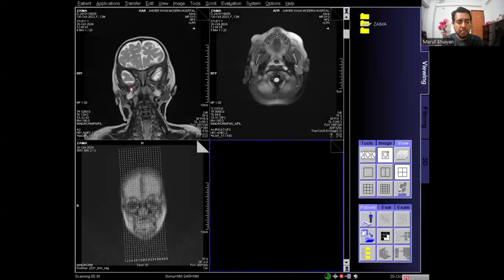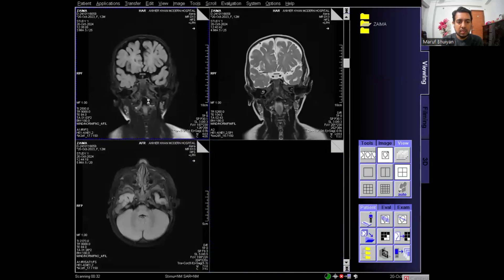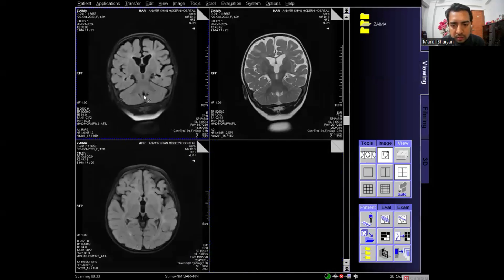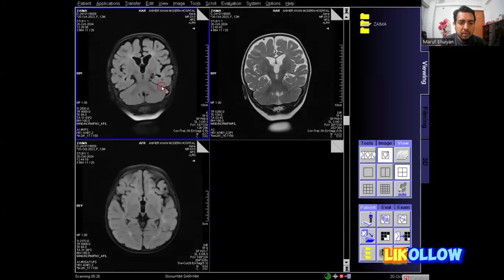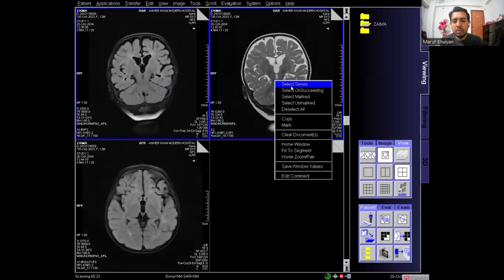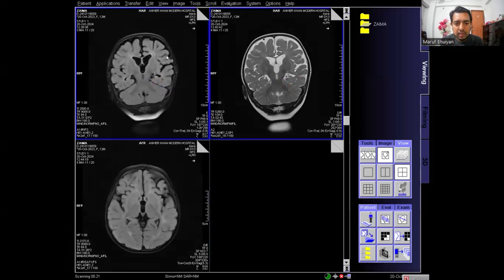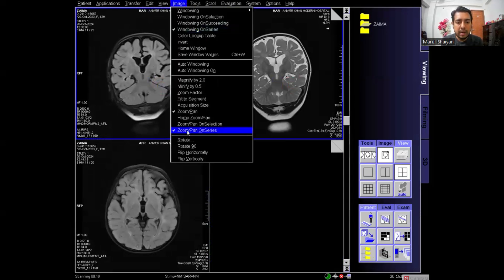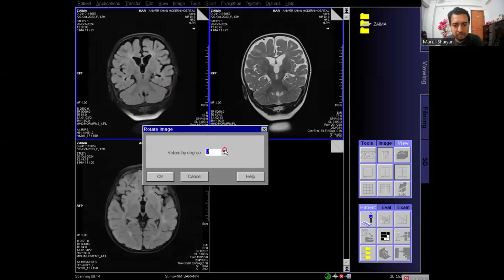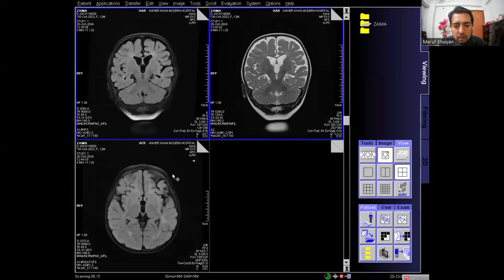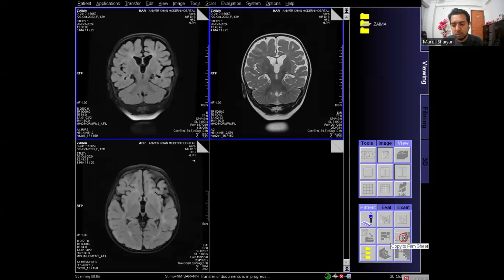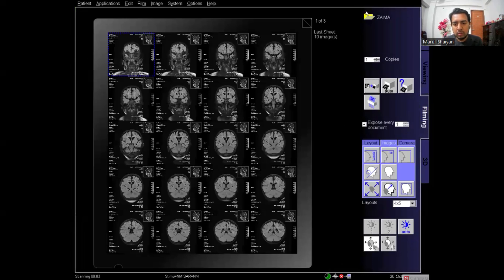These two coronal series are the epilepsy protocols — one is the T2 dark fluid coronal and one is the normal T2 coronal. I am selecting both series at the same time, rotating slightly so the images are properly listed, and sending these two protocols to filming together.